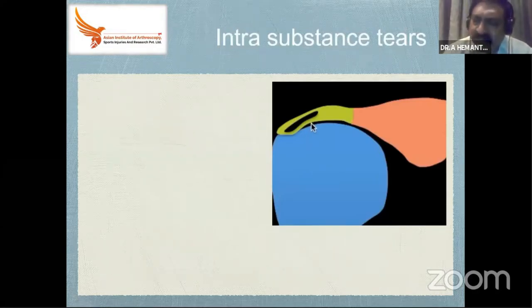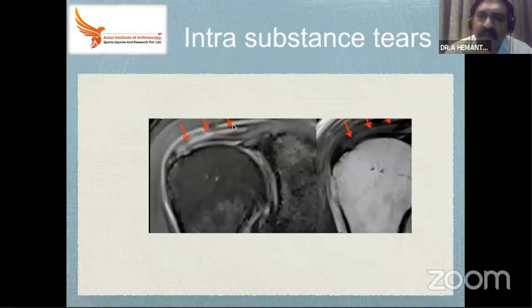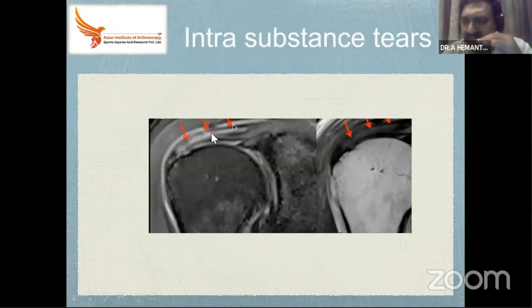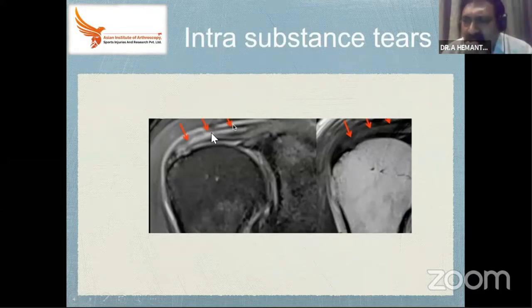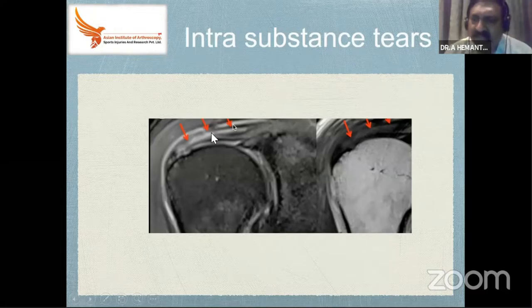How incomplete tears look: this is an intra-substance tear — in a classical intra-substance tear, between the two layers there will be fluid. The visual images give a lot of information. The partial bursal surface tear and how we can correlate it on MRI — this is how it looks on MRI. Then there is the partial articular surface tear as well.